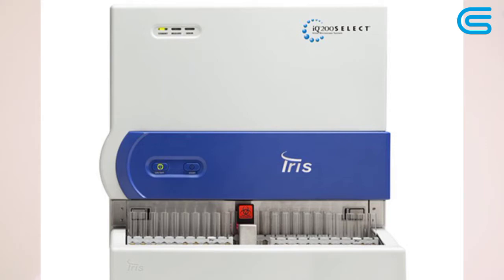It requires a minimum of 3 ml of urine and quantitates particles in 2 microliters of sample. It can also analyze 60 urine samples every hour.